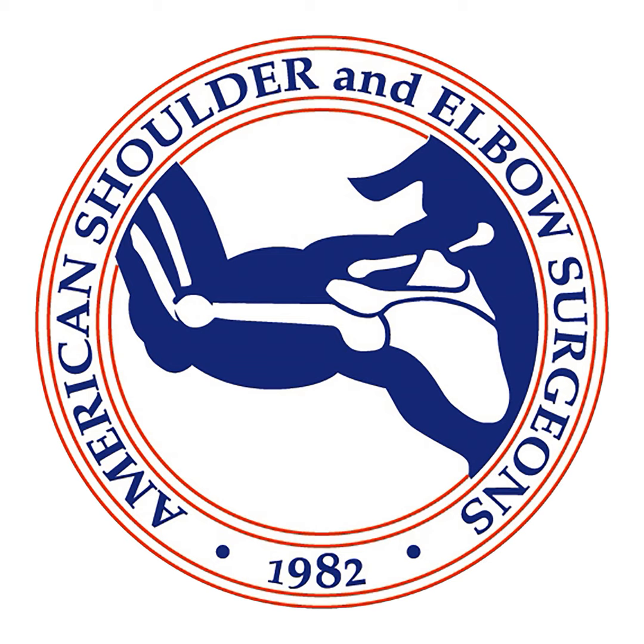I think one of the most difficult revisions is trying to explant a well-fixed, fully cemented humeral prosthesis. You can literally destroy the humerus trying to get a stem like that out. So with cementless implants, there's a lot of advantages, particularly for revision. But it does have some disadvantages too with a tight press fit.